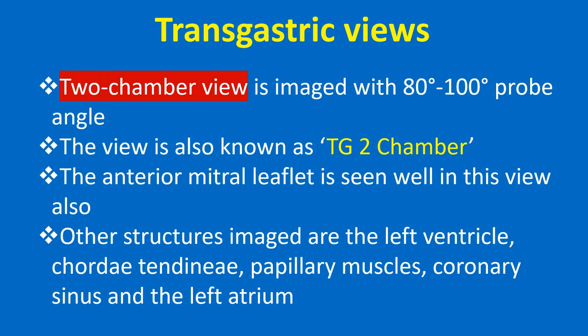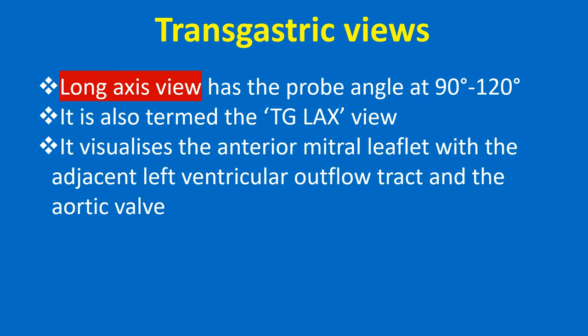The two-chamber view is imaged with 80-100 degrees probe angle, also known as TG two-chamber. The anterior mitral leaflet is seen well in this view. Other structures imaged are the left ventricle, chordae tendineae, papillary muscle, coronary sinus, and the left atrium.